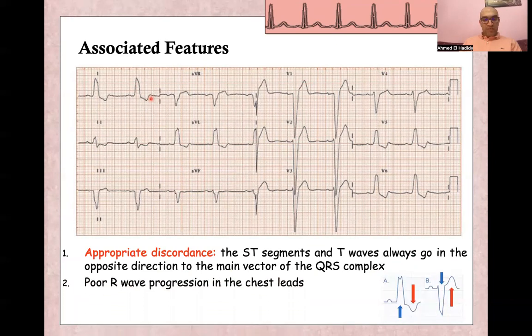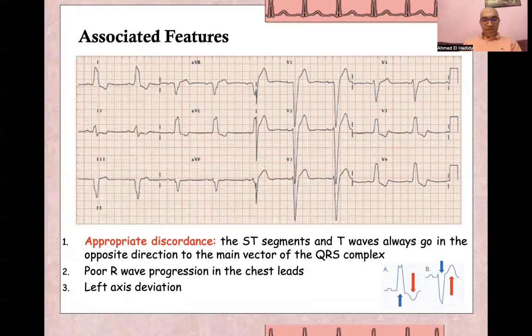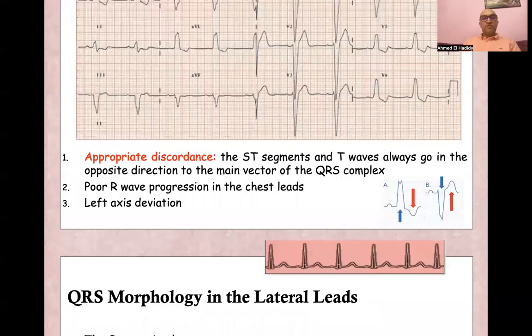Other features include poor R wave progression in the chest leads — the normal R wave progression is lost, going negative across the precordial leads before becoming positive. And of course, left axis deviation is also present.